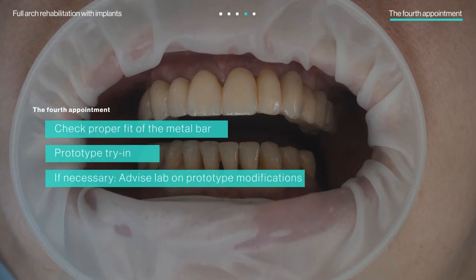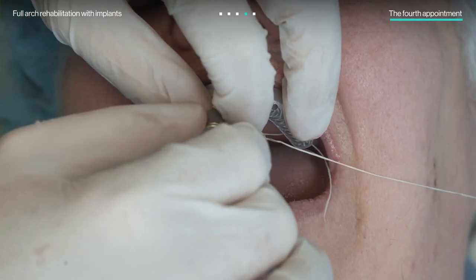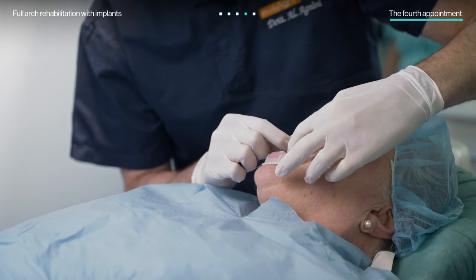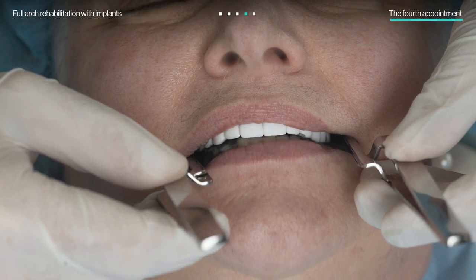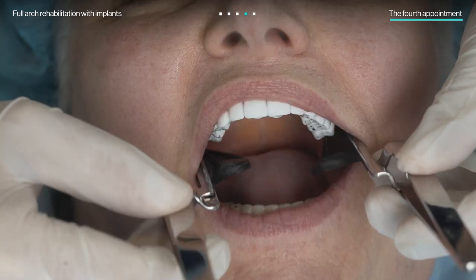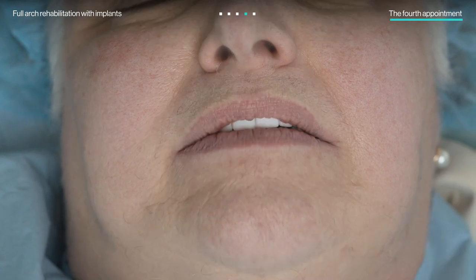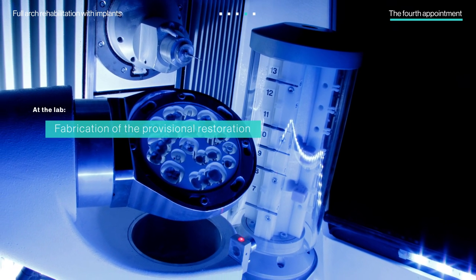At this appointment, the doctors checked to make sure the metal bar had a proper and passive fit. Then, with the PMMA prototype, they ensured a properly balanced occlusion and that the patient was satisfied with the appearance. If any occlusal adjustments are needed, doctors can modify the prototype and scan its occlusal part to advise the lab on any necessary modifications. If not, the lab can create the final restoration.